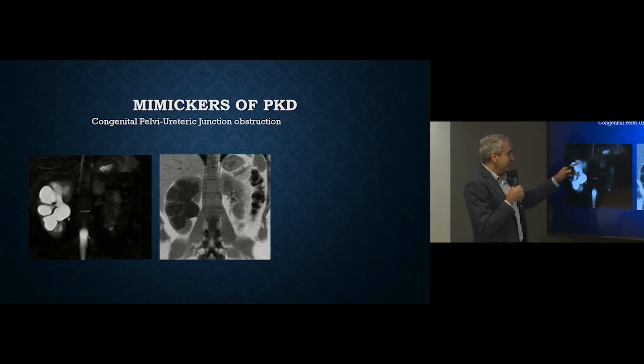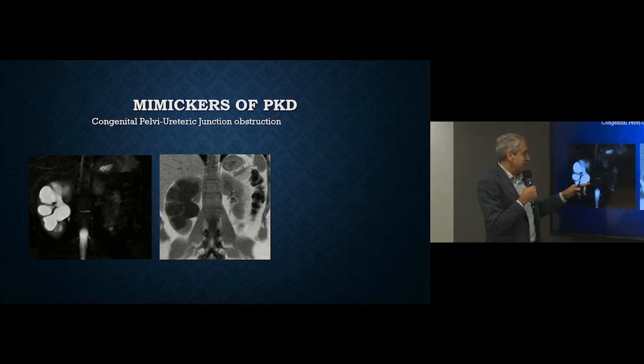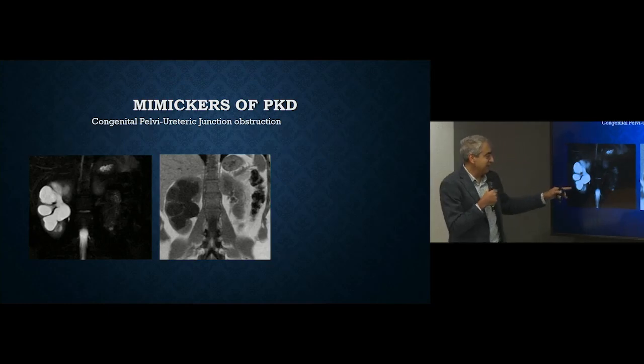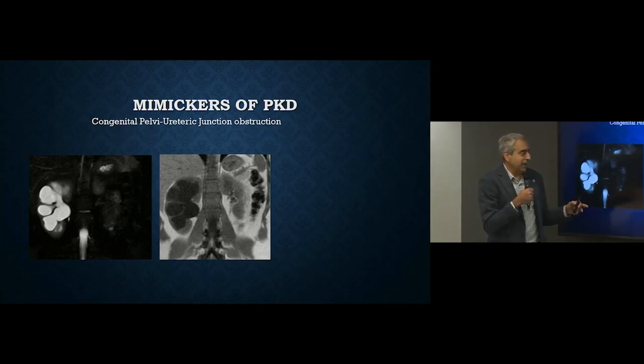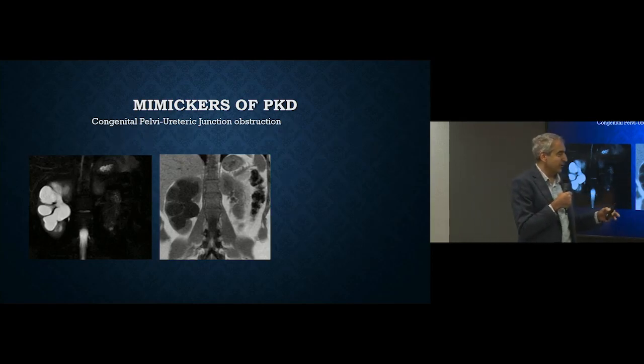This leads to dilatation of the collecting system, and so we can see that this can mimic cystic disease within the kidneys. And there is a little video clip. I'm not sure if it's going to work or not.